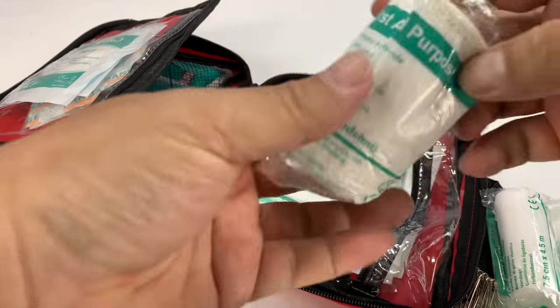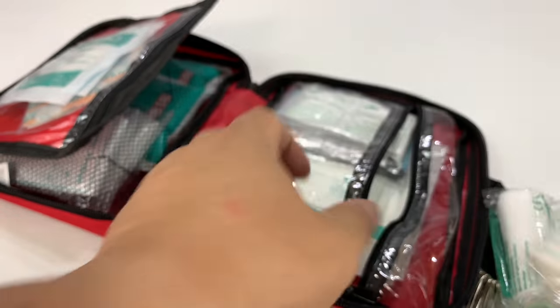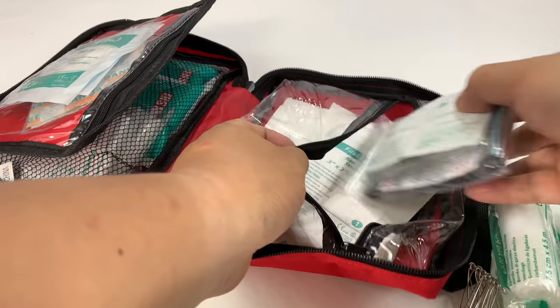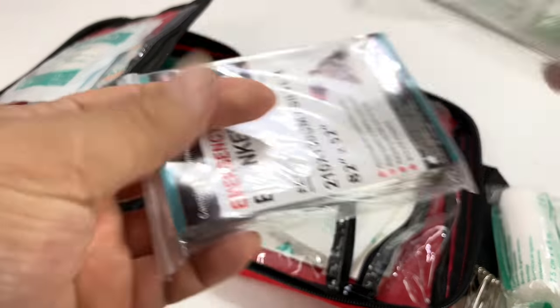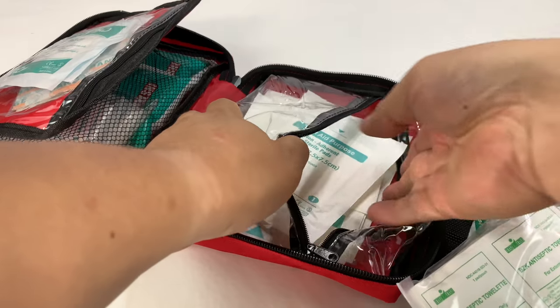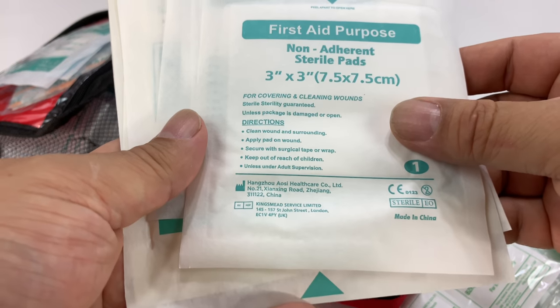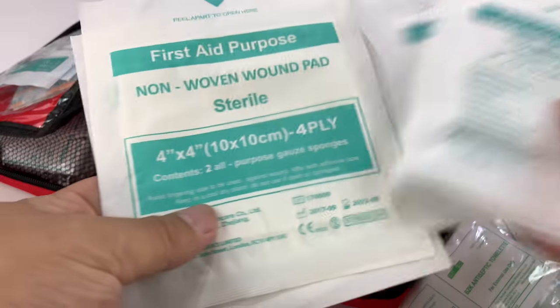We have what looks like an ace bandage — kind of a cloth elastic bandage. Then we have antiseptic wipes to wipe everything down. Emergency blanket — that's cool, to wrap someone up who needs it. Non-adherent sterile pads that you can put on open wounds. And then non-woven wound pads — three of those at least.